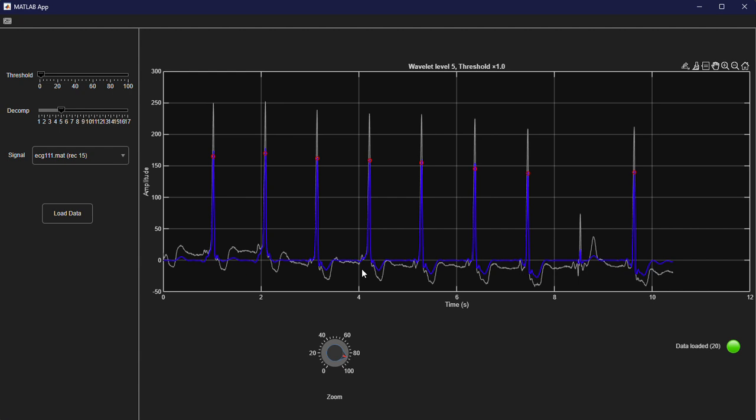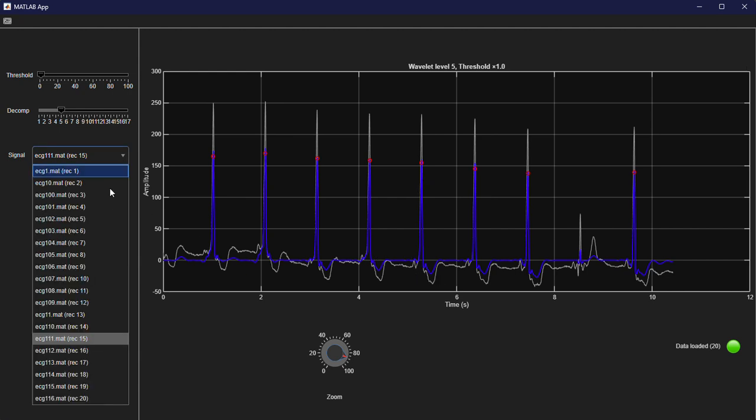And then we apply a QRS detection by squaring the derivative of that reconstructed signal. So this is post-inverse maximal overlap discrete wavelet transform. We apply a tunable moving average window, which we're still working on to get the most effective QRS detection. We then normalize the envelope, and we apply the find peaks function to label the peaks, the R peaks of the QRS component of the wave.